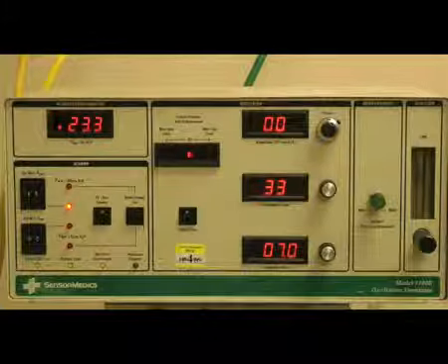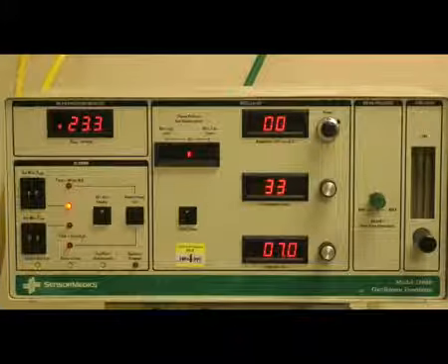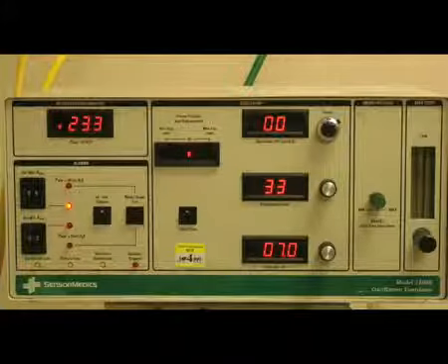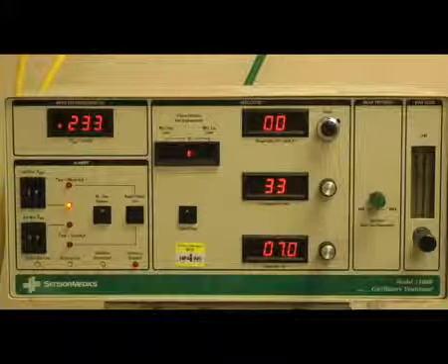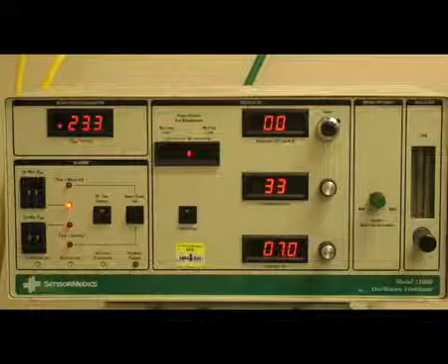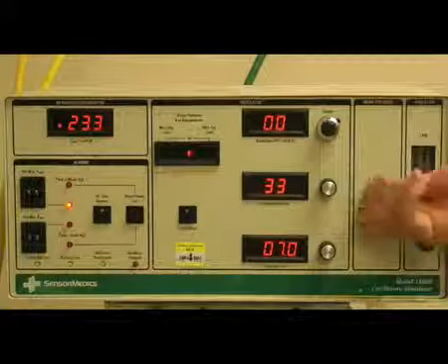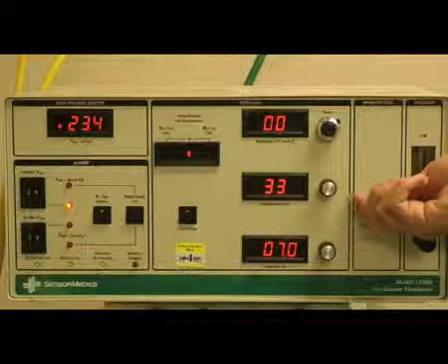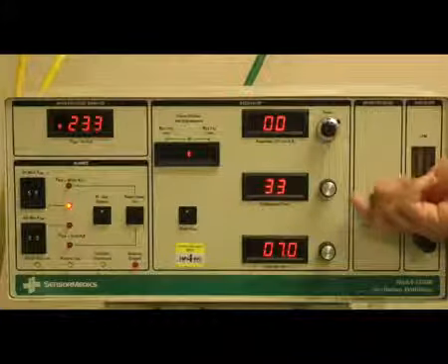After doing your initial recruitment maneuver, you'll want to determine if your oxygenation is within the goal range, and this will be determined by your SpO2. If your oxygenation is not within your goal range, you can repeat the recruitment maneuver, but you'll need to raise the mean airway pressure to 50 centimeters of water pressure and then reduce it to 36, again over a 45-second period.